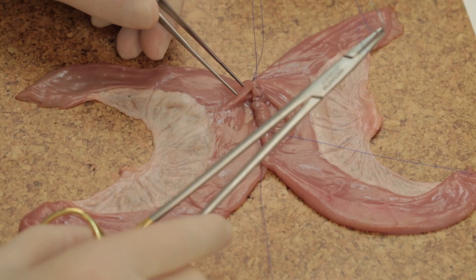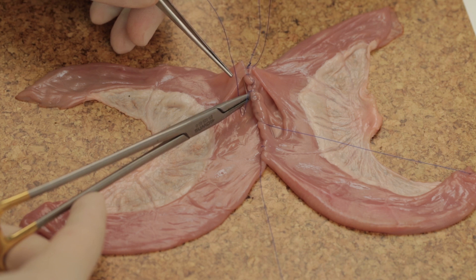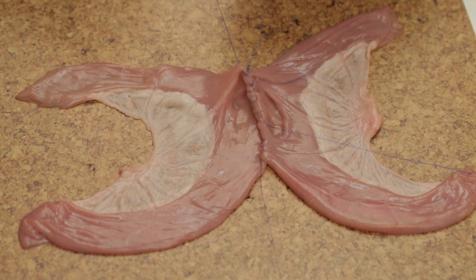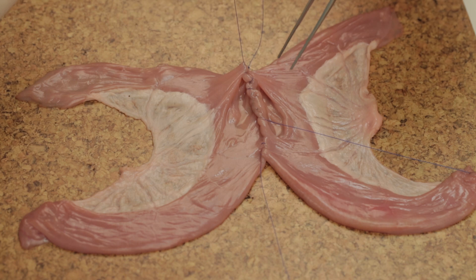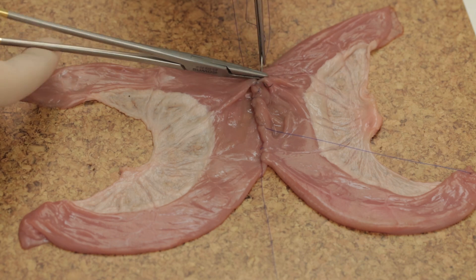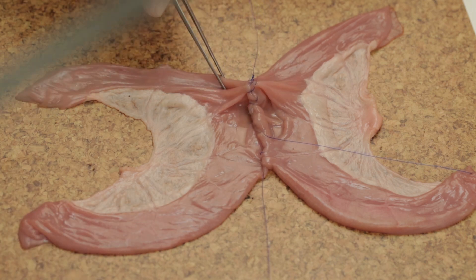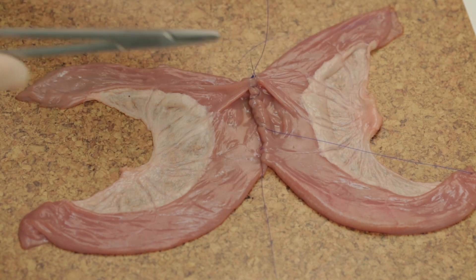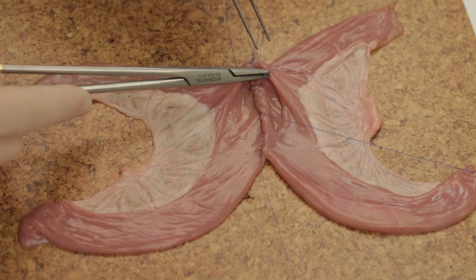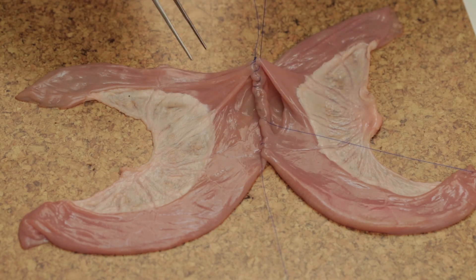To negotiate the corners, Connell suturing is used. At the apex, pass the needle from in to out. Cross to the other apex and pass the needle from out to in, then out again, to leave a loop on the mucosa. Further Connell stitches are inserted by crossing the midline and passing the needle from out to in, then in to out. Once around the corner, the anterior inner layer is formed by over and over all-coats stitches.